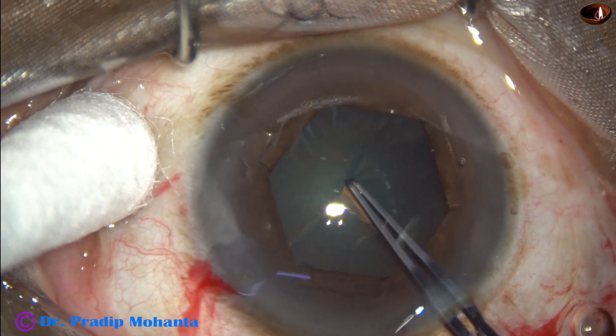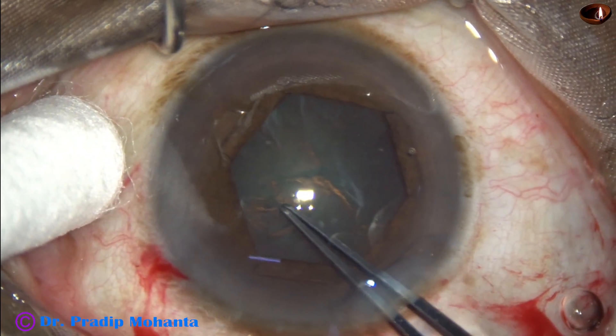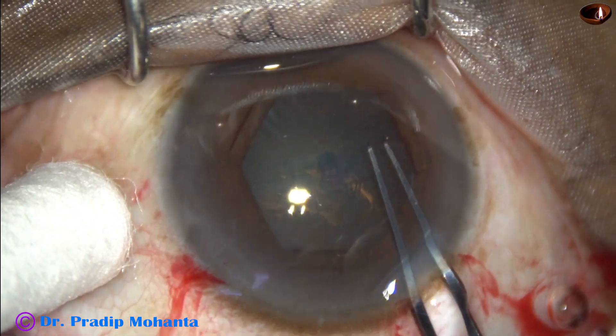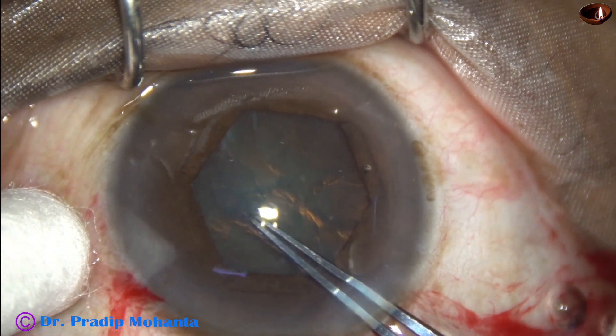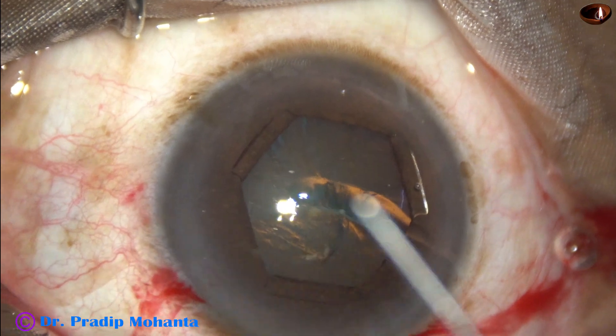Capsulorhexis is being done with the help of Utrata forceps. The size of the expanded pupil is about 5.5 millimeters and we are getting a rhexis of about 5.25 millimeters, which is an adequate size capsulorhexis.